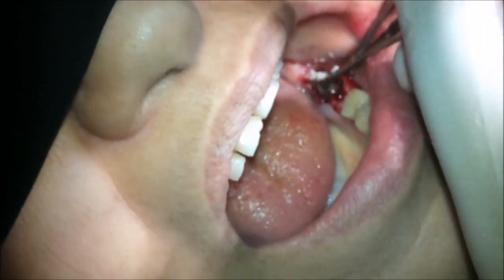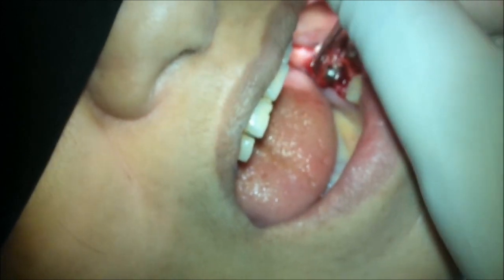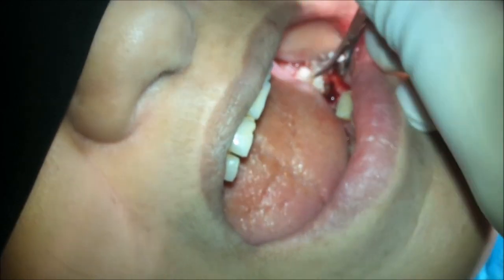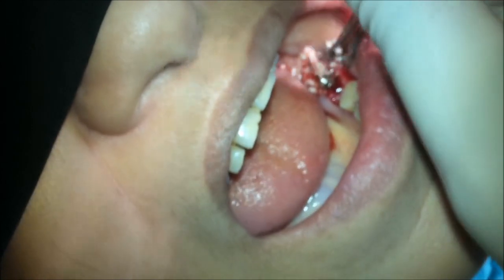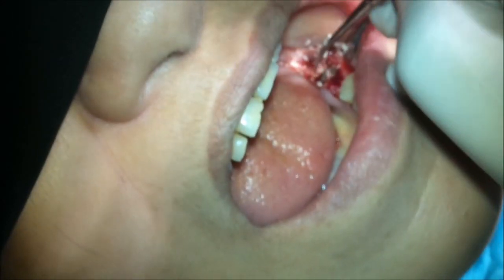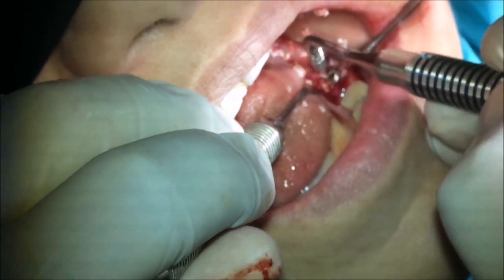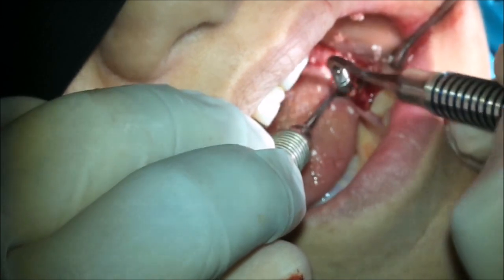According to the bone graft particle size, I prefer to use large size bone graft granules so that we have enough blood supply for the bone graft granules. Also, while packing, we avoid overpacking of the bone graft. We use gentle condensation force.